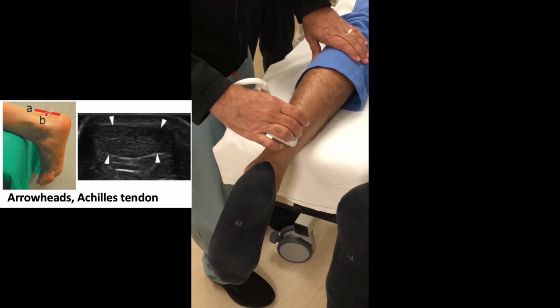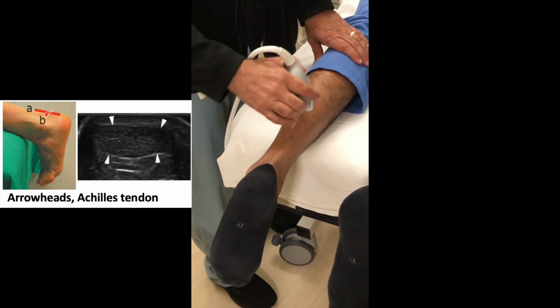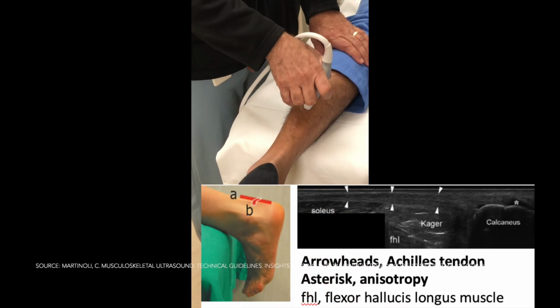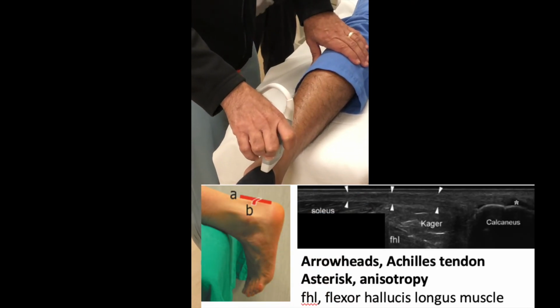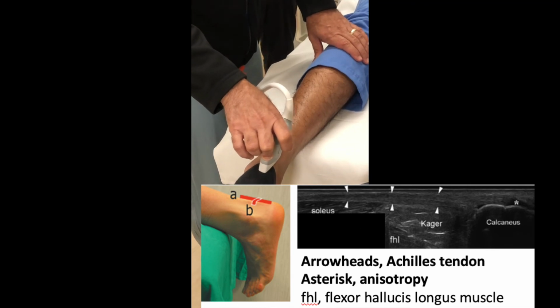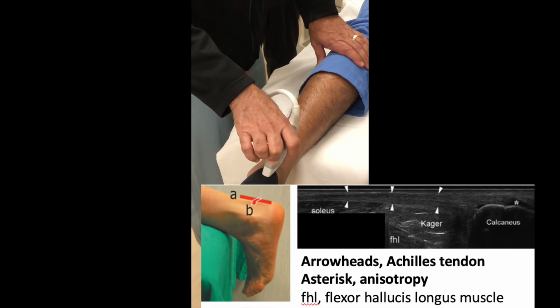We will follow the Achilles tendon in short axis all the way to its insertion. And we will do the same in long axis, working our way down, looking for tendinosis or tears. When we reach the level of the calcaneus posteriorly, we will look for any fluid collection, namely retrocalcaneal bursitis.